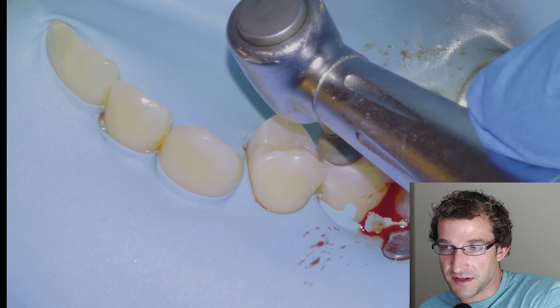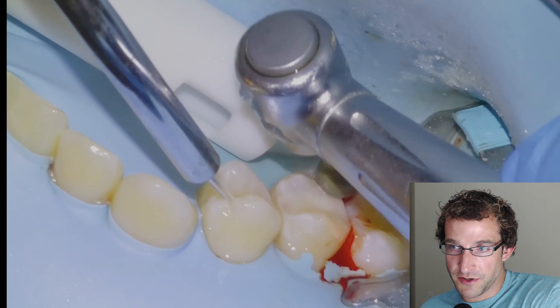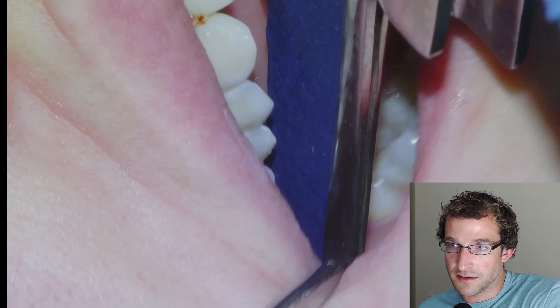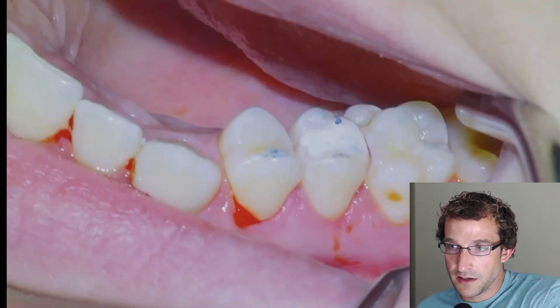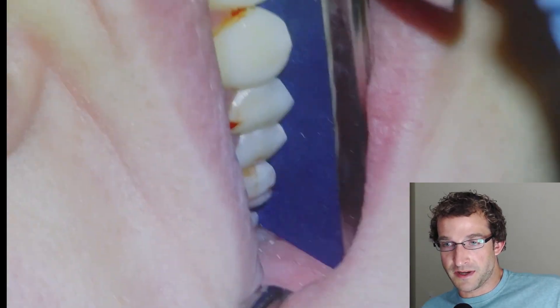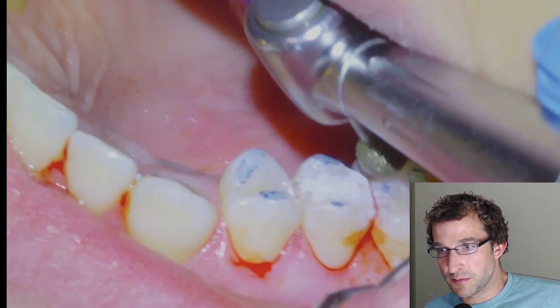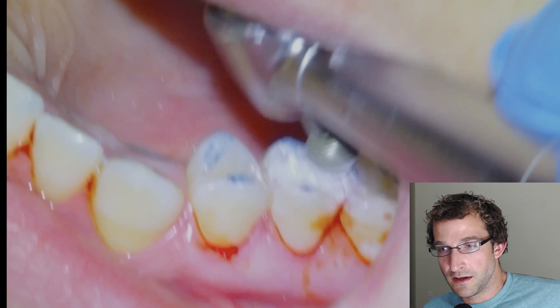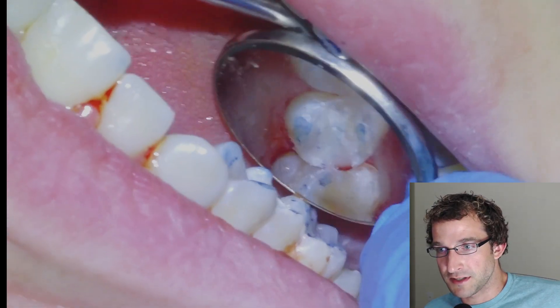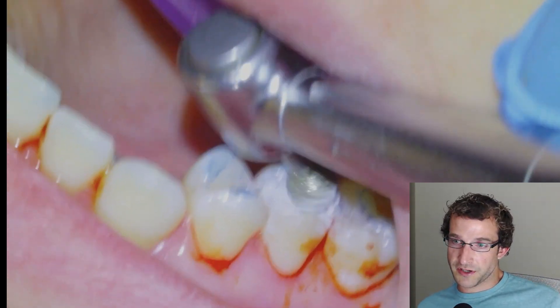Then I'm going to use a super large round diamond on a slow speed — I get this from Strauss — and start checking the bite. Having the patient bite down and grind, we can see a high spot on the restorative material, so we'll take that down until we have contact on the natural tooth. Still a little ways to go, but getting close. We'll make finishing touches and make sure there's no contact on the restorative material.